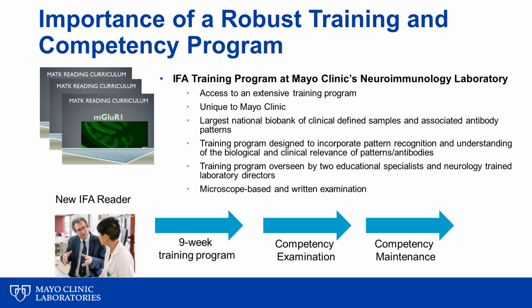Given the critical importance of tissue immunofluorescence interpretation in these neural antibody evaluations, it's extremely important that the testing laboratory build out a robust training program to maintain a high quality of interpretation. Our group at Mayo Clinic developed a 9-week-long training program to ensure that the staff interpreting tissue and cell-based immunofluorescence assays are able to correctly identify all reportable antibodies with high sensitivity and specificity. Furthermore, all positive cases are reviewed by a neurologist or a Ph.D. level laboratory director prior to reporting out results.